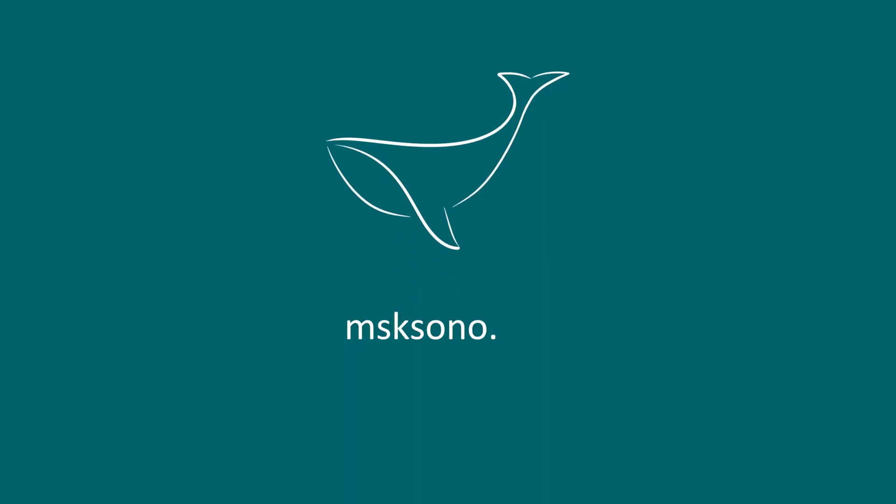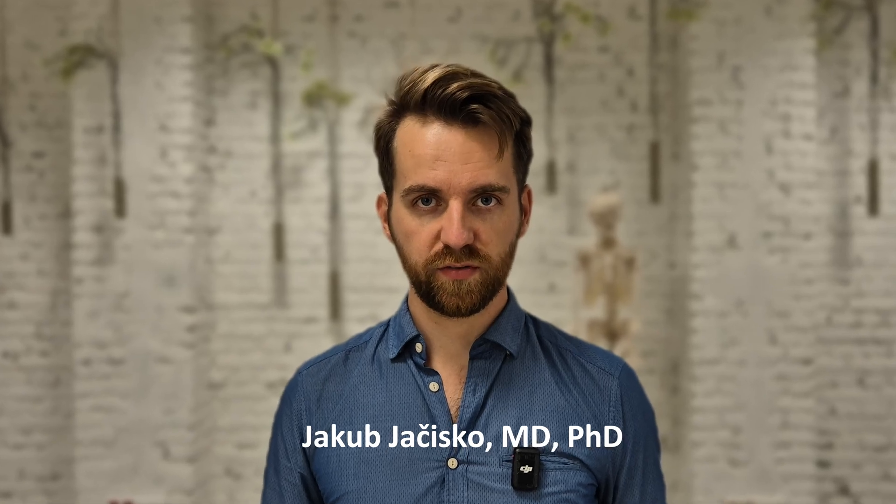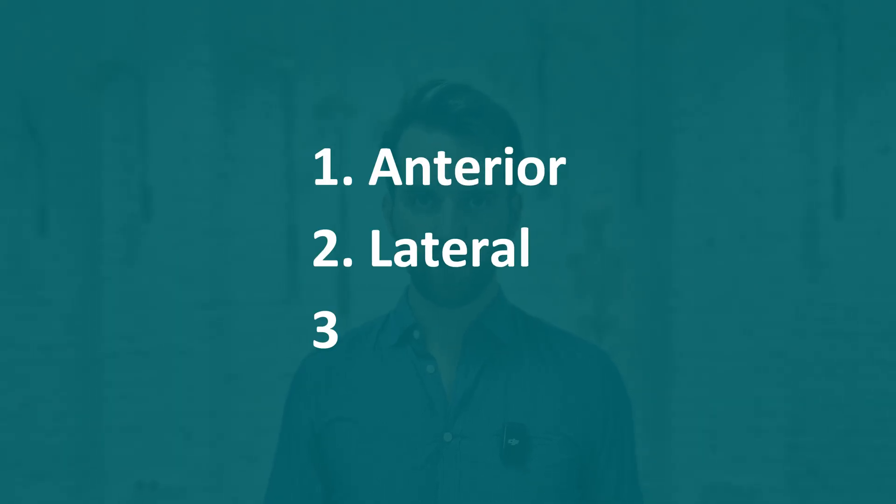In this video I'm going to show you the basic ultrasound examination protocol of the shoulder. My name is Jakub and I am a physical medicine and rehabilitation specialist. Today I will guide you through the basic examination protocol of the shoulder. I will show you where to look for joint fluid and how to identify soft tissue structures around the shoulder. We will examine the shoulder from three different views: anterior, lateral, and posterior.